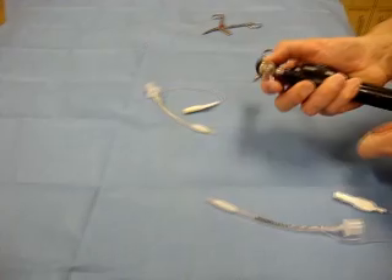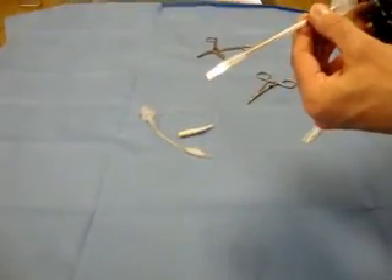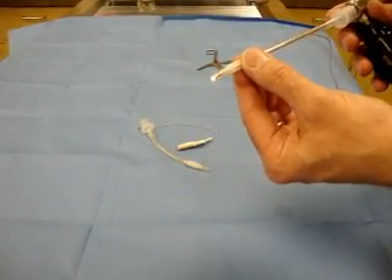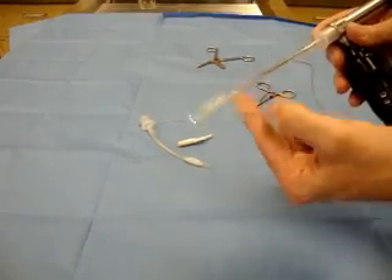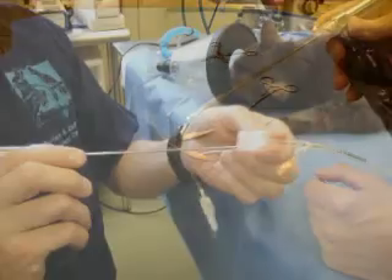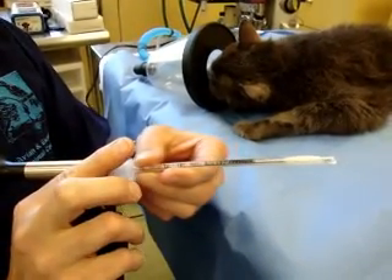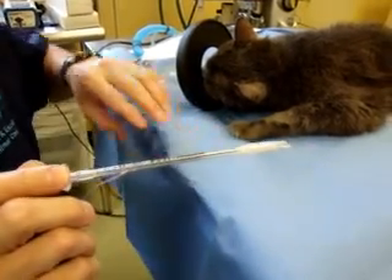I've turned on the light source, and now we can see the tube goes down. We want the endoscope to come just to the end of the tube and act as a stylet for our endotracheal tube. So we insert our endoscope into the endotracheal tube to create a stylet.